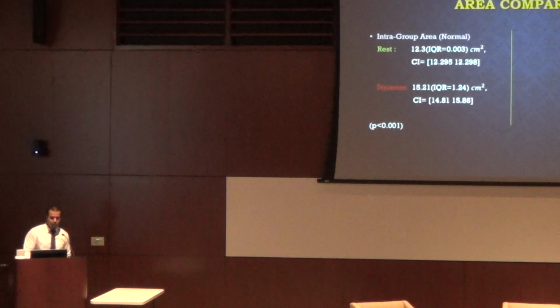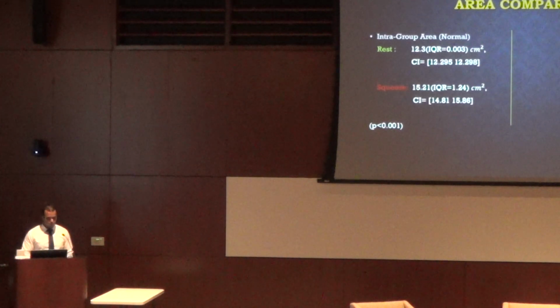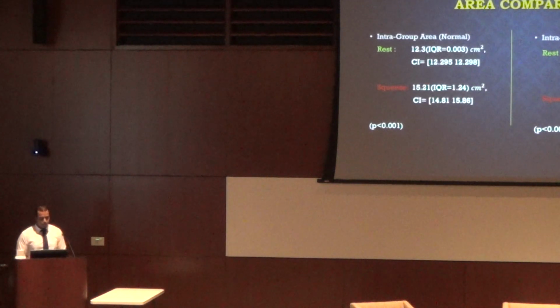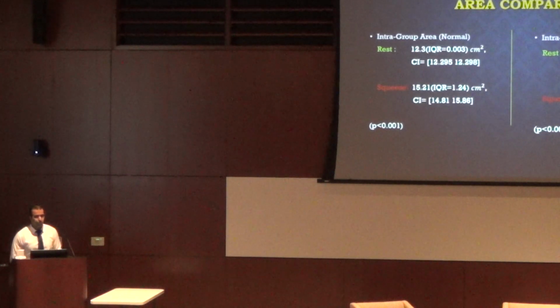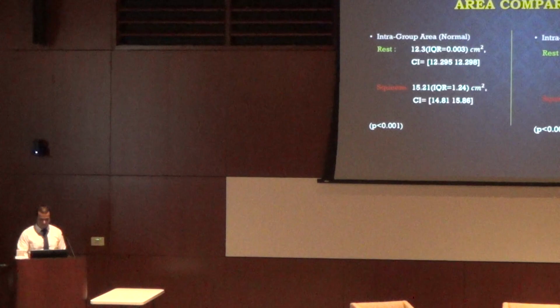In terms of area, you had a 12.3 at rest, centimeters squared, going to 15.21. And for the patients, you have a 12.51 to a 13.7, so you have a greater increase in the area in the normal group.